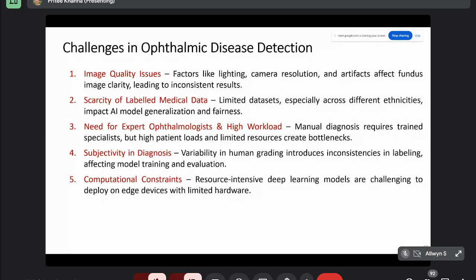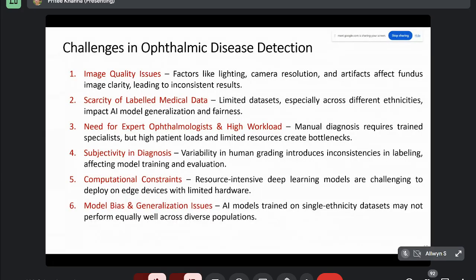actually, the teeth. So with the device, what we want again is that the device captures data, and our model analyzes it. There is a mobile app, and quickly on the mobile app, it gives you the findings, and it shares data with the expert from there itself. So you can get the expert's opinion as well as our model's opinion. So if you want to do all these things on an edge device, then your model must be a lightweight model. So that is again a problem.